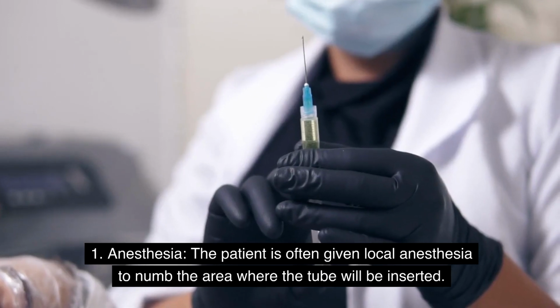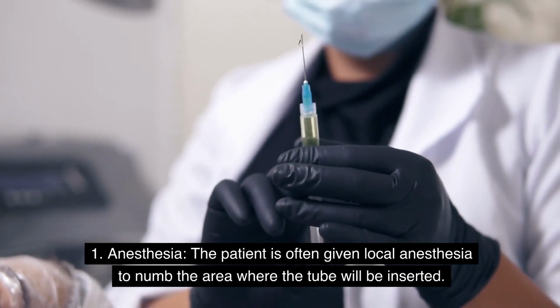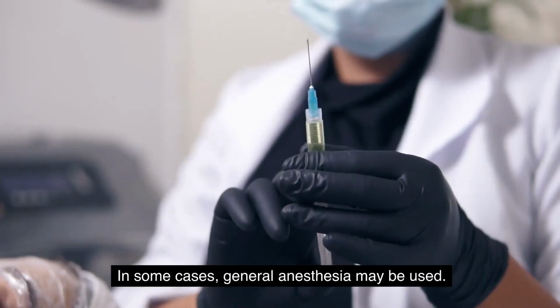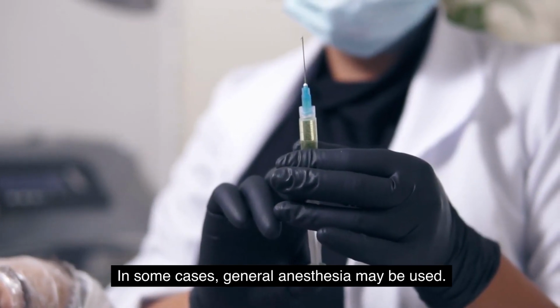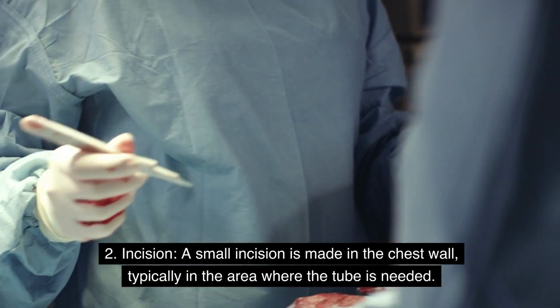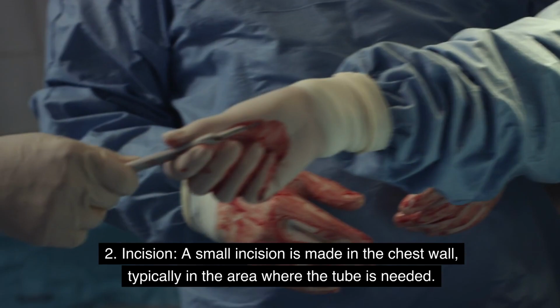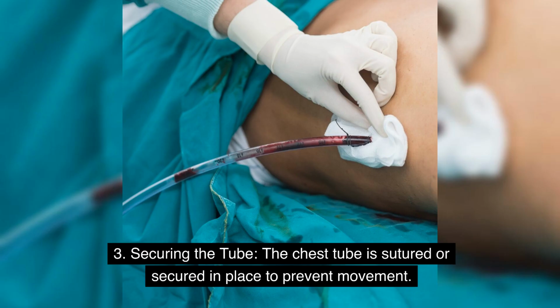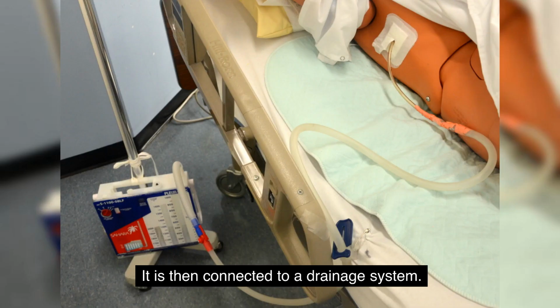1. Anesthesia. The patient is often given local anesthesia to numb the area where the tube will be inserted. In some cases, general anesthesia may be used. 2. Incision. A small incision is made in the chest wall, typically in the area where the tube is needed. The healthcare provider carefully inserts the tube into the pleural space. 3. Securing the tube. The chest tube is sutured or secured in place to prevent movement. It is then connected to a drainage system.